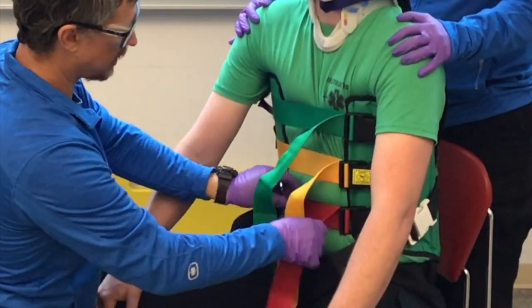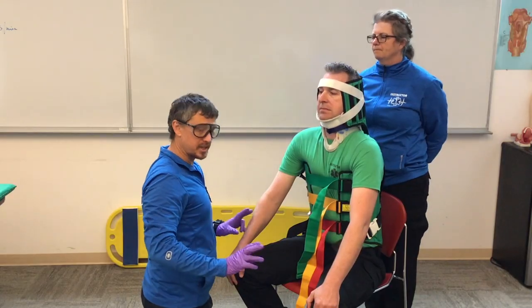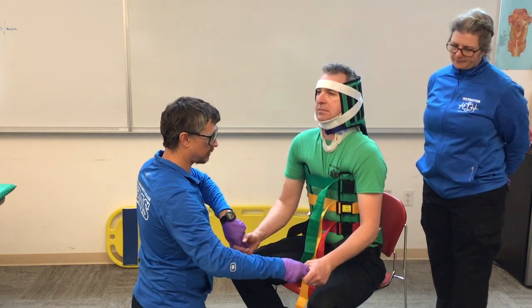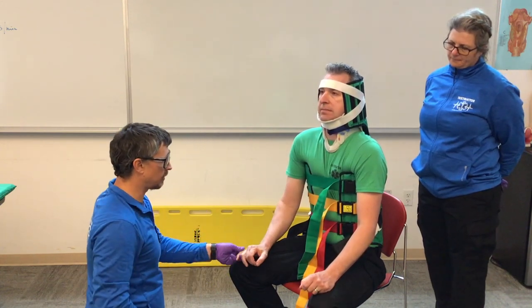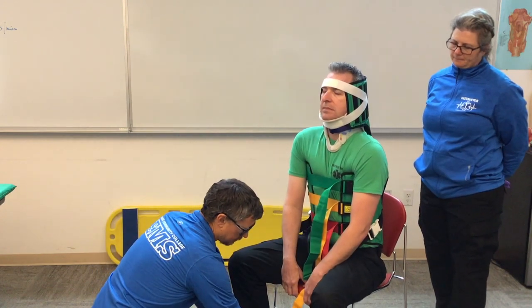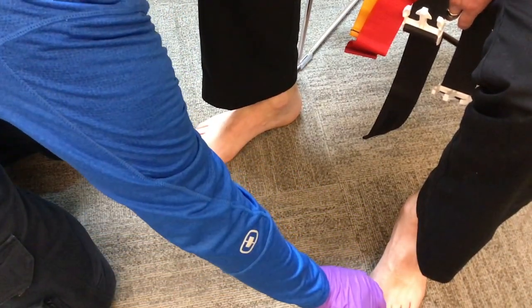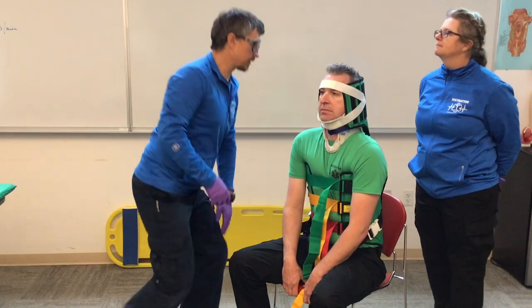Before moving Chandler, I secure the top strap — because this strap can impede his breathing, I use the push-and-pull technique to tighten it without rotating him. Then I reevaluate all straps and recheck my CMS: pulses are good, equal bilateral. Can you wiggle your toes? Can you tell which toe I'm touching?